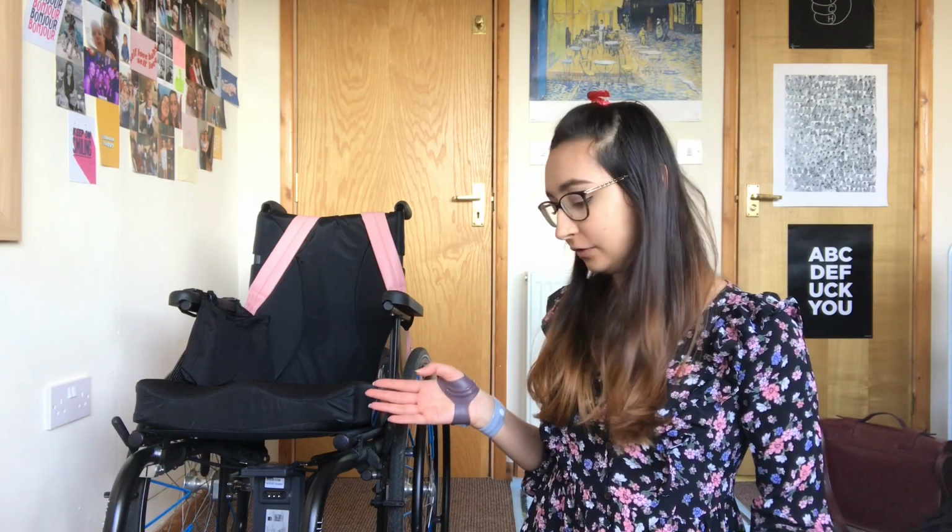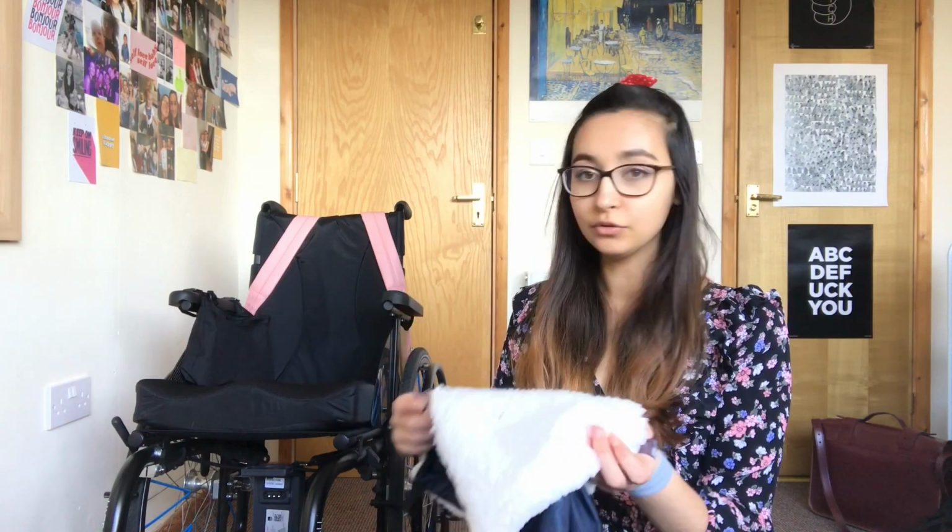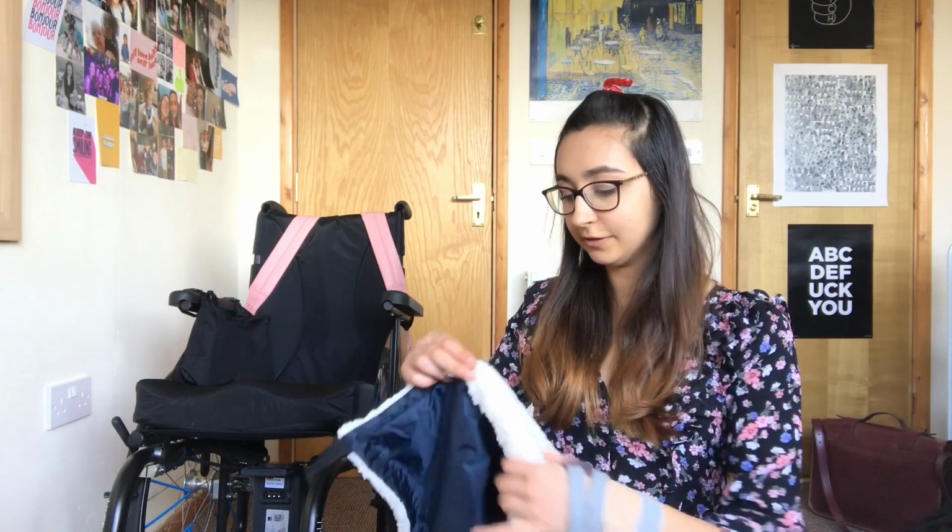I've got one more thing, and I don't use it very often, but actually it is kind of a necessity for me, and I feel a bit self-conscious using it, but it's one of those things that if you have to do it, you just have to do it. I've got quite severe autonomic dysfunction, and so I have a wheelchair cozy. I'll put it on the wheelchair and show you what this looks like.